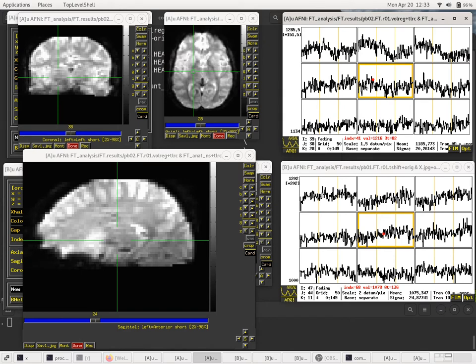You can't pull data back in from where it was not acquired. So effectively, there's no way to fully correct for that motion. You just can't do it. To some degree, that's why I call motion the bane of fMRI. This is something that's always going to be a problem, and you can't correct the data to make it as if the motion never happened.